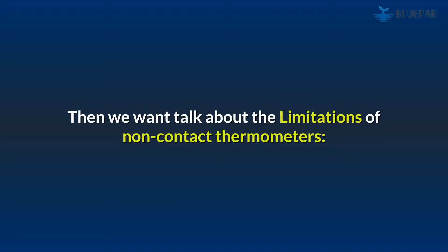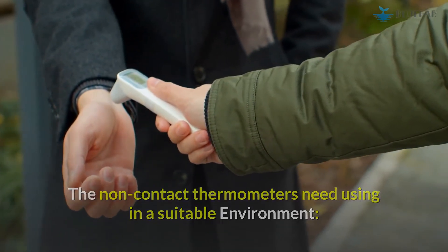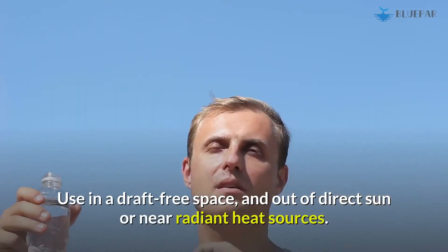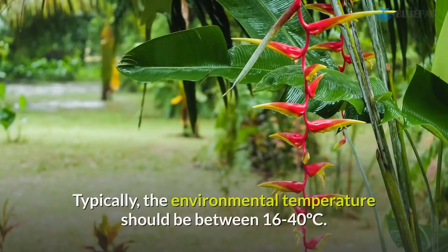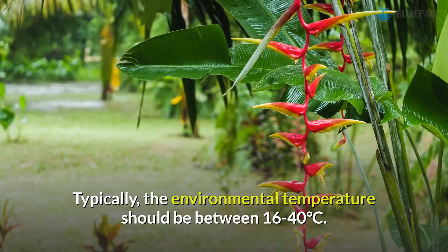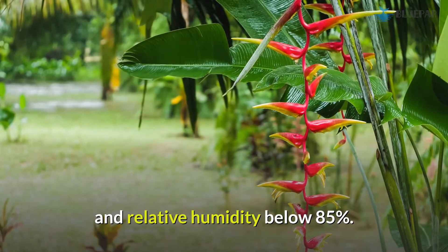Now let's talk about the limitations of non-contact thermometers. They need to be used in a suitable environment — in a draft-free space, out of direct sun, and away from radiant heat sources. Typically, the environmental temperature should be between 16 to 40 degrees Celsius, and relative humidity should be below 85%.